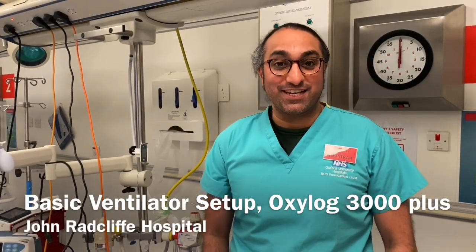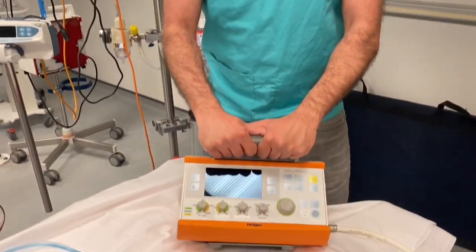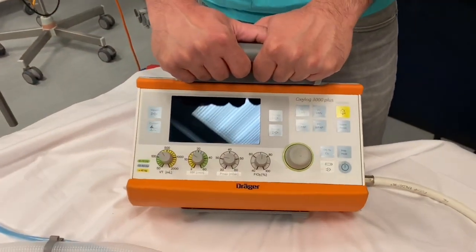Hi guys, I'm Jaz, one of the senior registrars here in the emergency department of the Oxford University Hospitals. Today I just wanted to talk you through the basic setup of the Oxilog 3000 portable ventilator unit. This is what we will be using for a lot of our hypoxic respiratory failure patients.